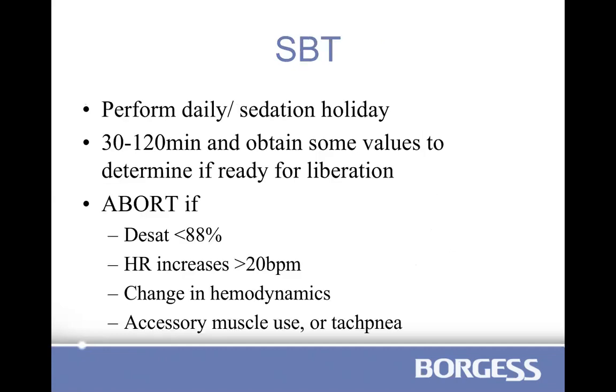Okay, kind of running out of time, so we're going to quickly go over spontaneous breathing trials, which should be performed every day in conjunction with the sedation holiday. Things that cause you to abort are obviously a desat, change in your hemodynamics, and respiratory rate. So those are things that usually stop your spontaneous breathing trial.